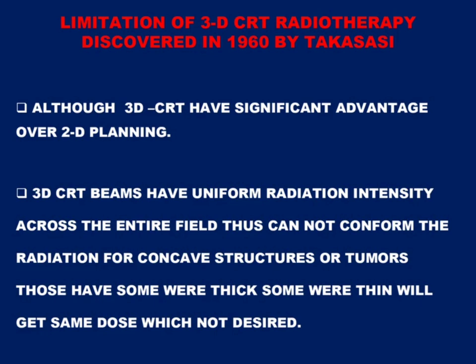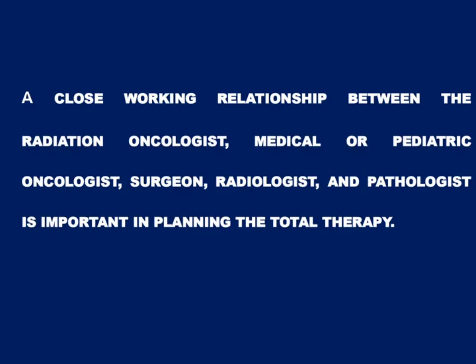Failure to provide the estimate of error, inadequate definition of geometric coverage of anatomical structure by external beams, and a failure of providing tools for specifying and verifying the accuracy of treatment delivery were the problems. So there were certain problems and limitations in 2D planning that further propelled people to look for three-dimensional radiotherapy planning, the three-dimensional conformal radiotherapy planning.